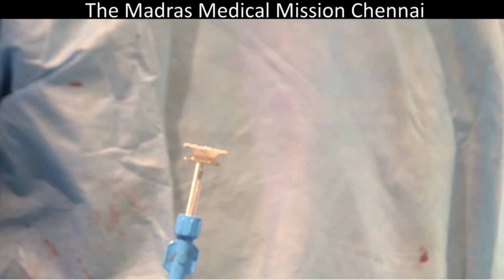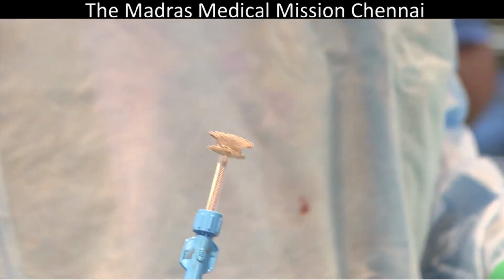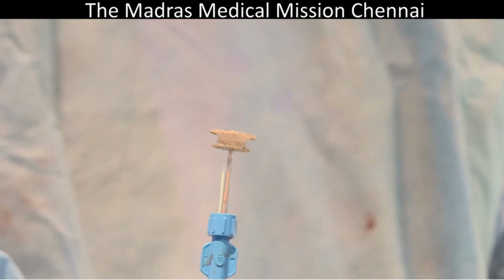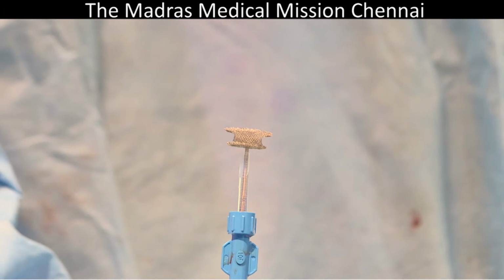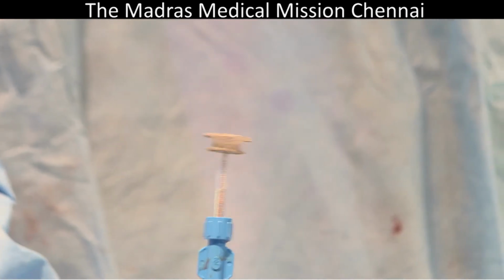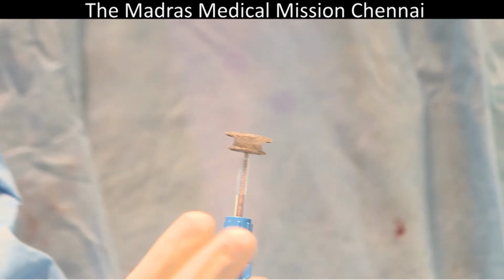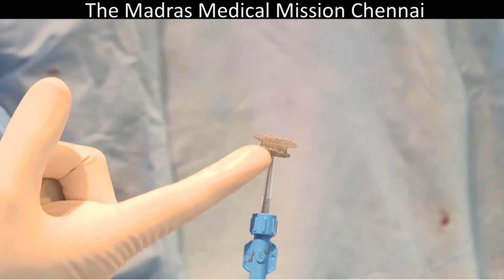What is your intention now? We are planning to close it with a double disc device. We want to have a larger disc on the aorta and a smaller disc on the pulmonary artery. Since it is a grown-up patient, the pressures were similar? No, the pressure on the aorta is 140, and on the pulmonary side is only 50.